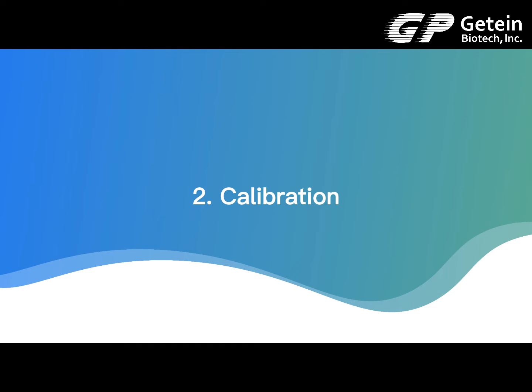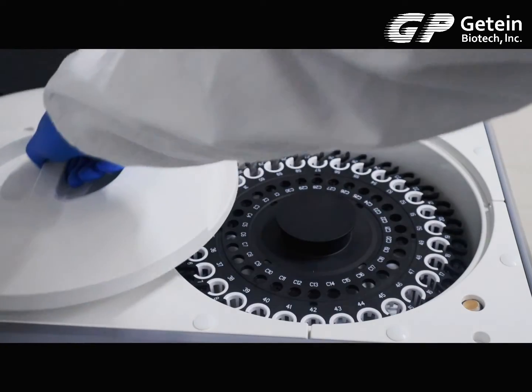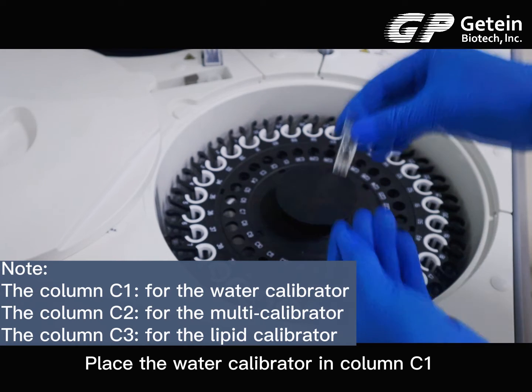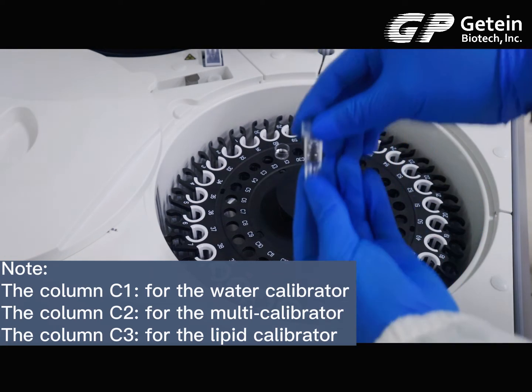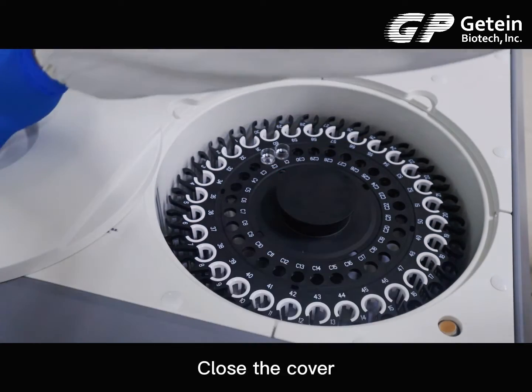Calibration. Open the sample tray cover. Place the water calibrator in column C1. Place the multi-calibrator in column C2. Close the cover.